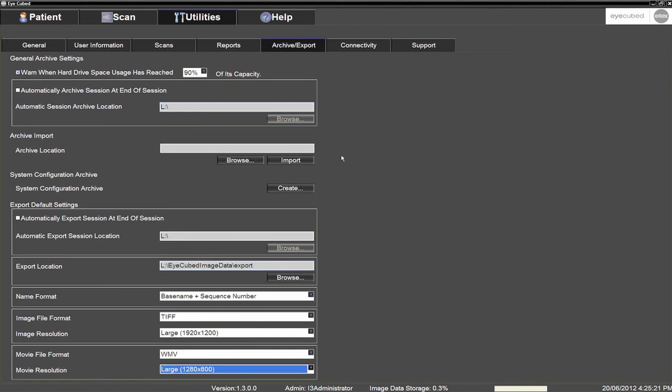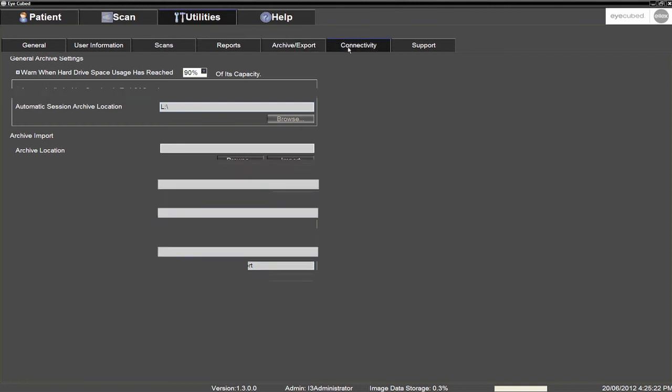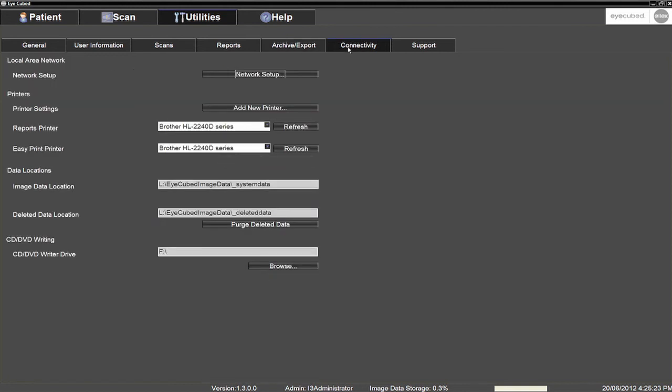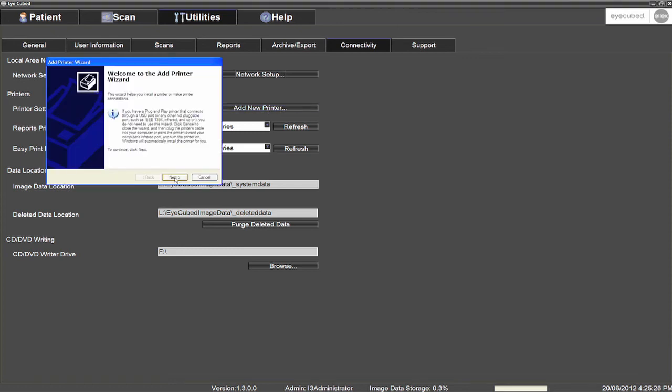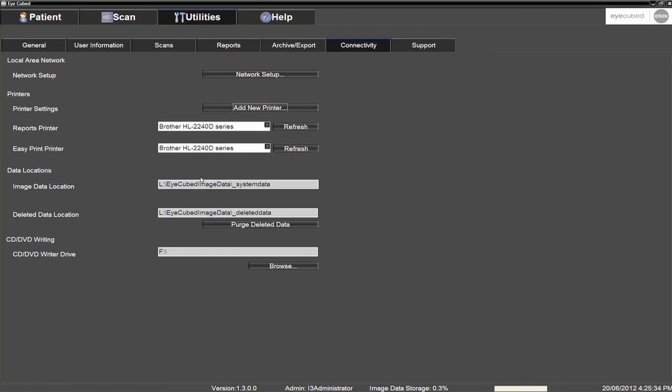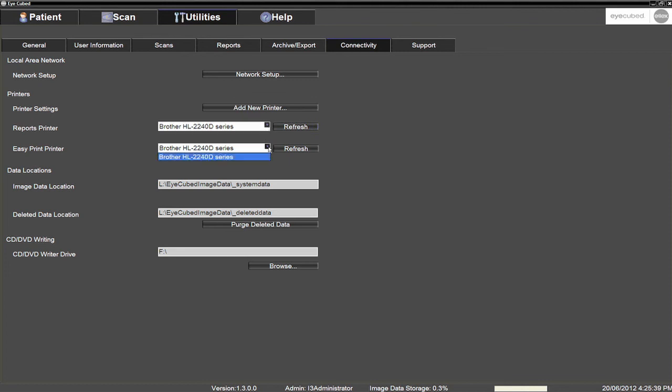As a last step, add a new printer via the Connectivity sub-tab. This process is the same as that of Windows XP. Select the default printer to be used when printing reports, as well as the default EasyPrint printer for images to be printed from the keyboard shortcut.